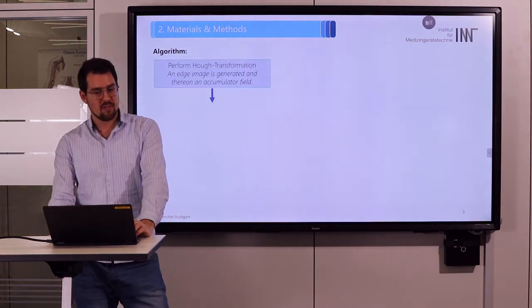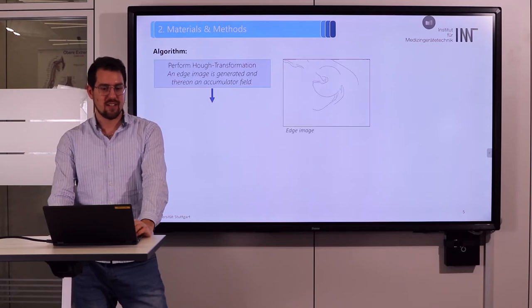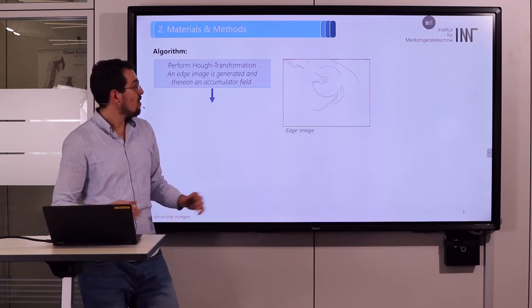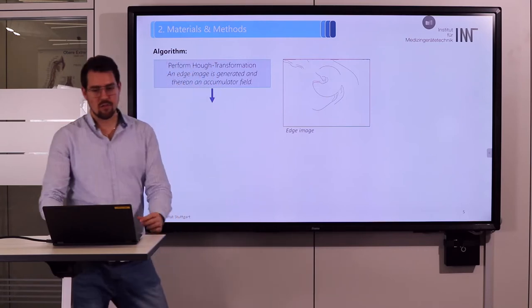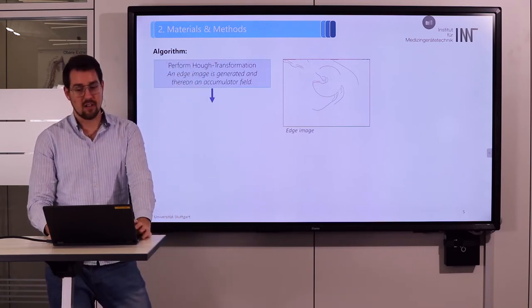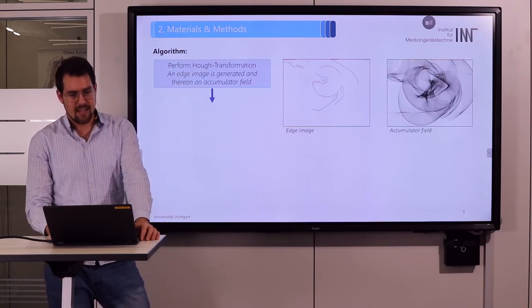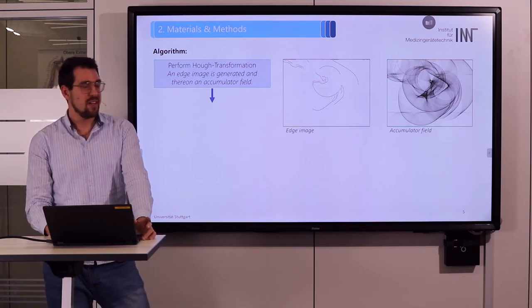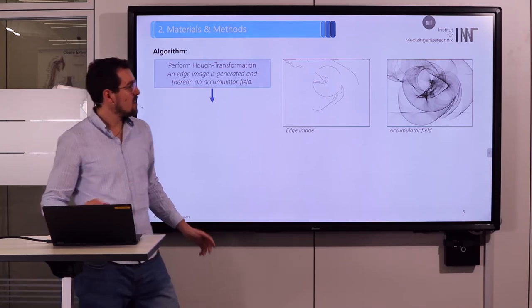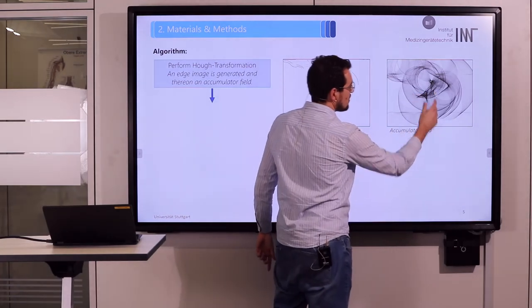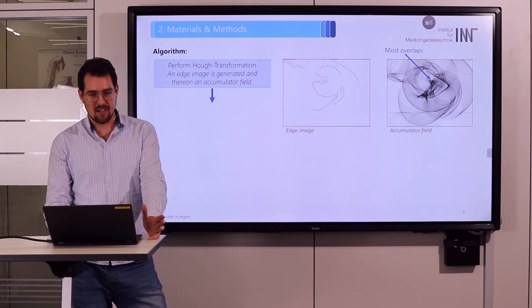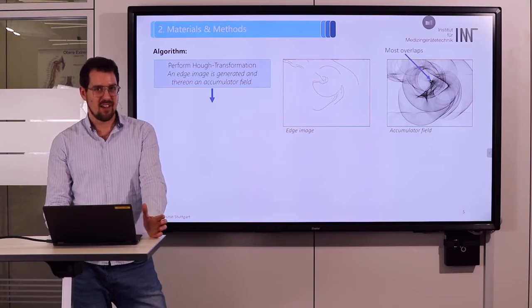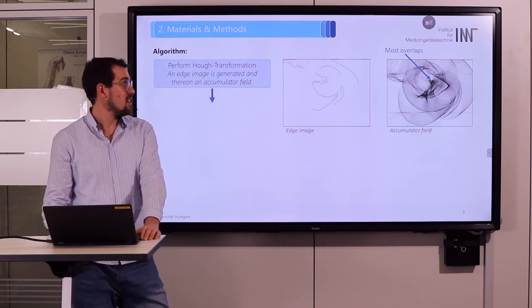For this purpose an edge image is generated. On each of these edge points we draw another circle and store it into a cumulative field. In this field there are overlaps, which you can see as darker areas. At the point where the most overlaps are is actually our searched circle center.